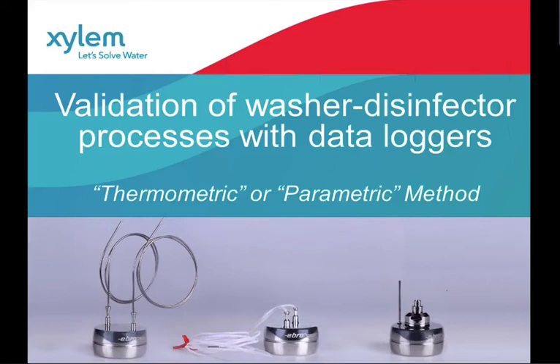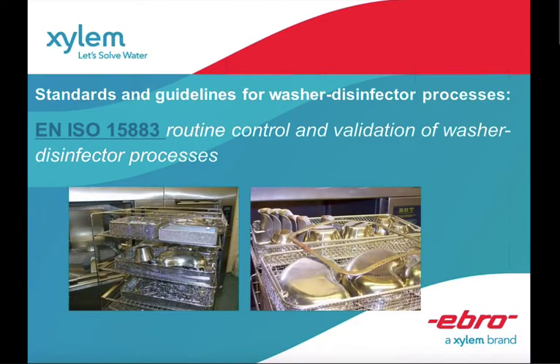Okay, now we go into details about washer disinfector processes, but not using chemical indicators, but this time using data loggers. The use of data loggers is actually acceptable, and we call it a thermometric or parametric method of measurement.